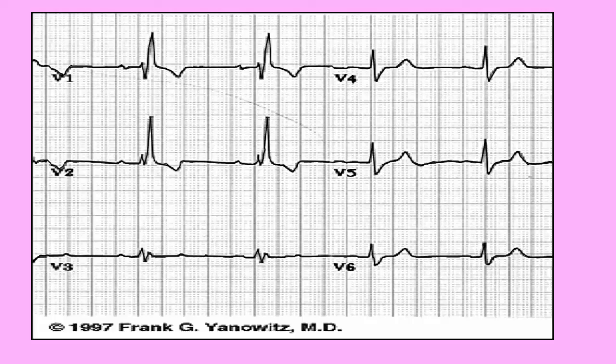Another case was a posterior wall MI, where the R wave is bigger in V1. Another case was right ventricular hypertrophy. And then so far today we've added 3 more situations to this: type A and type C WPW, consider that to be 2, and now right bundle branch block. So again, the normal R wave should be small in V1 and the S wave should be bigger. Those are 6 exceptions to the rule, and you think of how to differentiate those 6 from each other. In the case of right bundle branch block, you actually have 2 R waves, so that would be a quick distinction from one to the other.